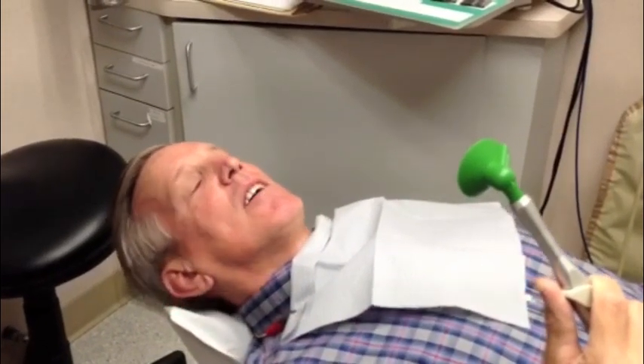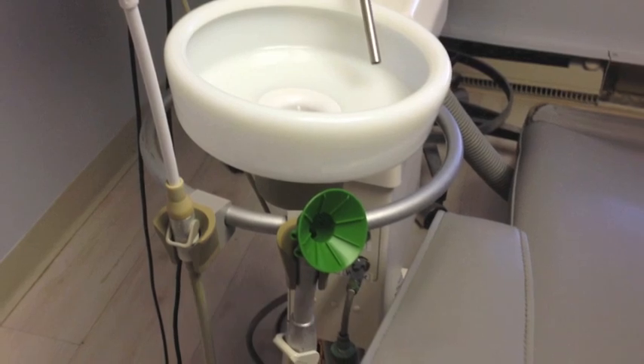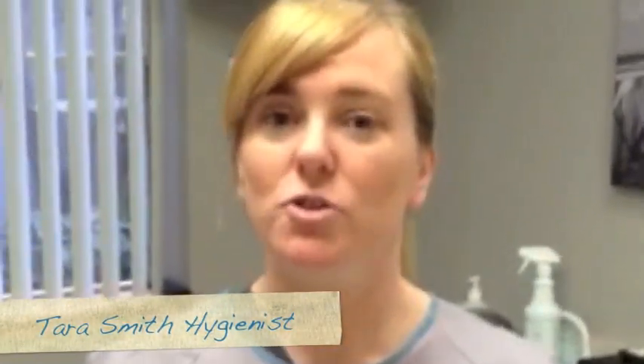This one really allows you to move all the water to the front of your mouth and get it out. I like this. What do you call it? The Expectorator. Even I know that 'expectorate' means to spit. Yes! This is really clever — you guys are great. You know, this product really sucks, having a suction that a patient can use and have control over their spitting.